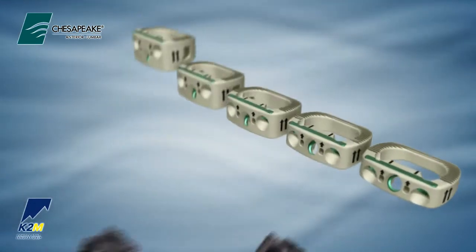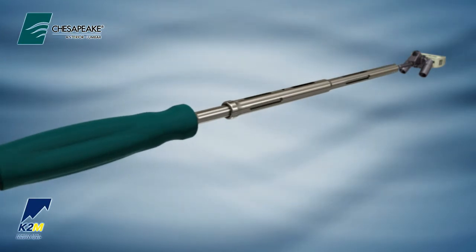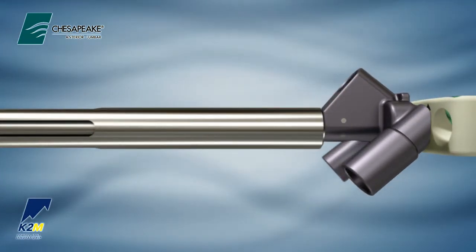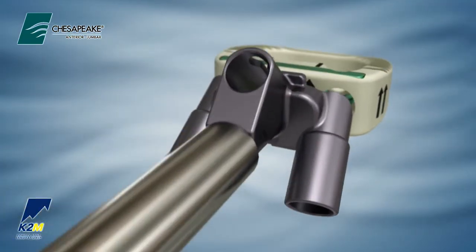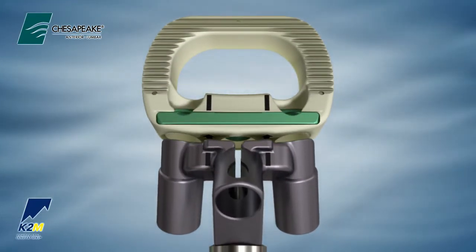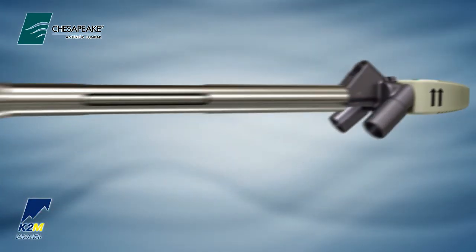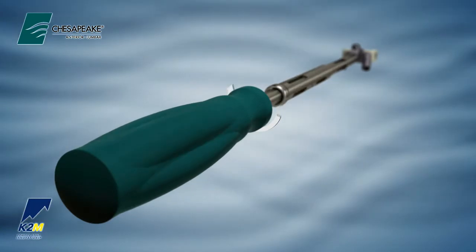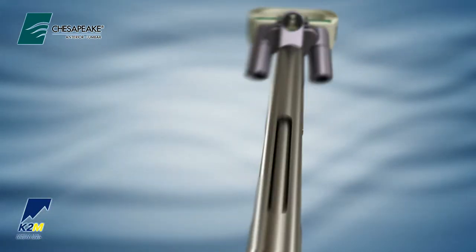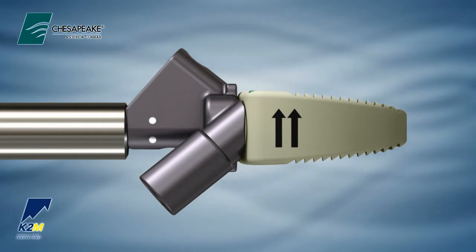Choose the three-barrel drill guide of the corresponding implant height. Attach to the drill guide inserter by pulling back on the outer shaft of the instrument and matching up the flats to lock in place. Insert the guide into the implant, making sure to match up the markings for correct screw orientation. Turn the handle clockwise to lock the drill guide into the implant. The barrels are fixed at a 40-degree trajectory and accommodate the awl, drill, tap, and driver.